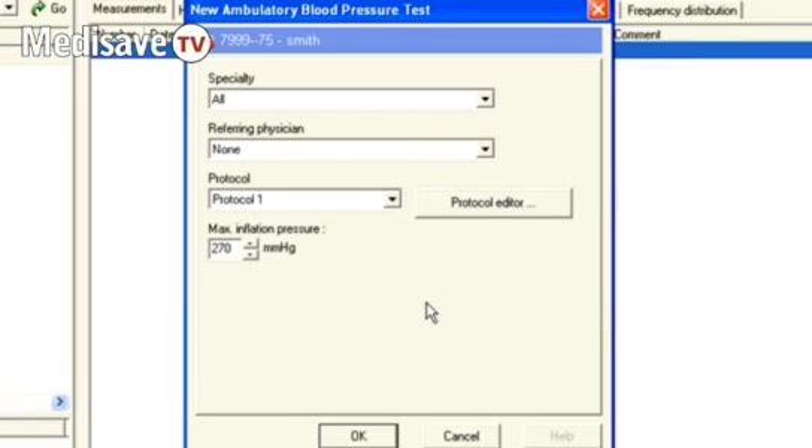You can preset all of the timings for this. So if you wanted to time to the British Hypertension Society recommendations of every half hour during the day and an hour during the night, you can preset that so you don't need to change those for every patient. But you can also take the maximum inflation pressure down from 270 to whatever you want it to be for a particular patient.